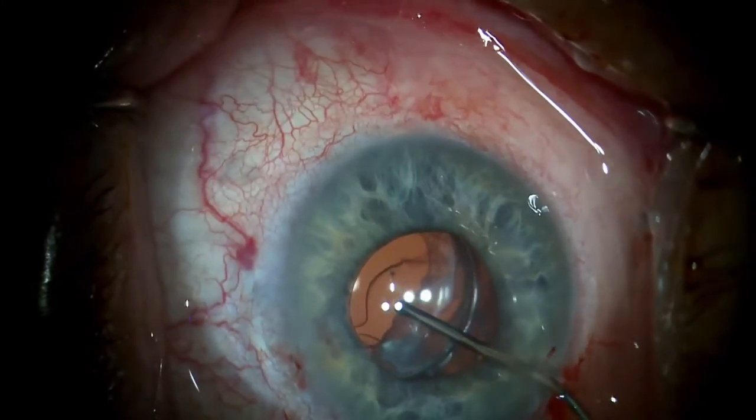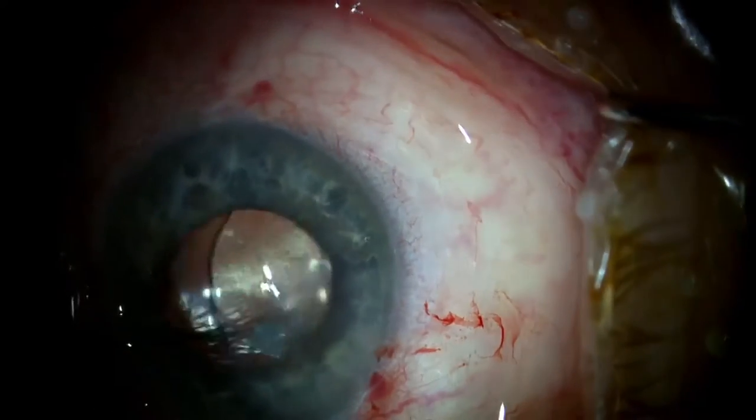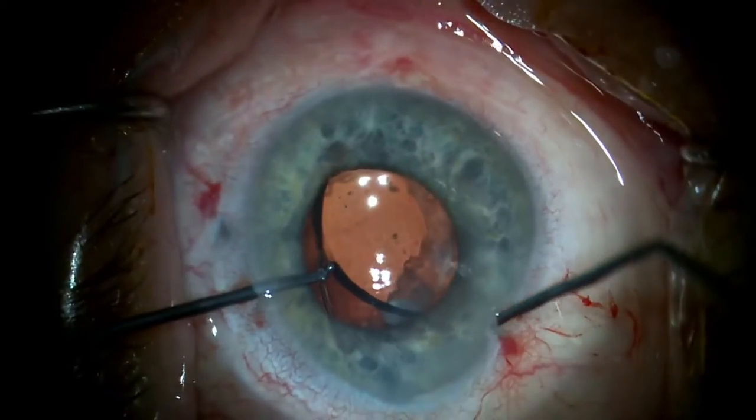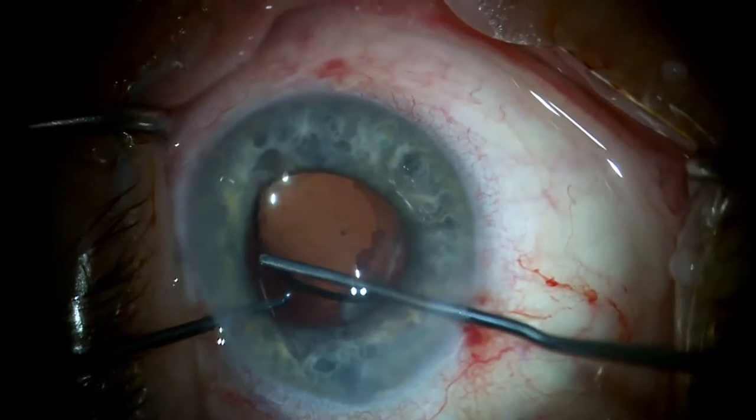Some additional OVD is injected between the IOLs to help elevate the piggyback. One haptic is hooked from below with a straight Ogawa Mini IOL manipulator to elevate the optic above the iris plane.